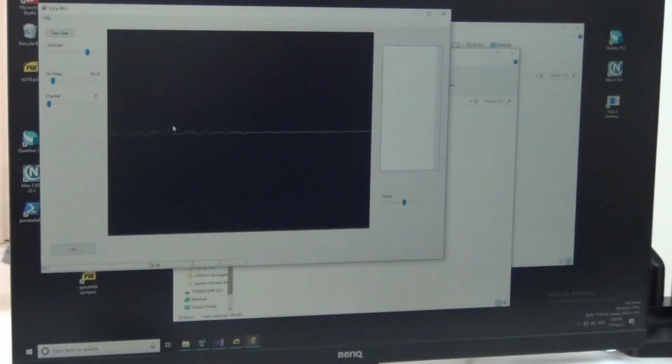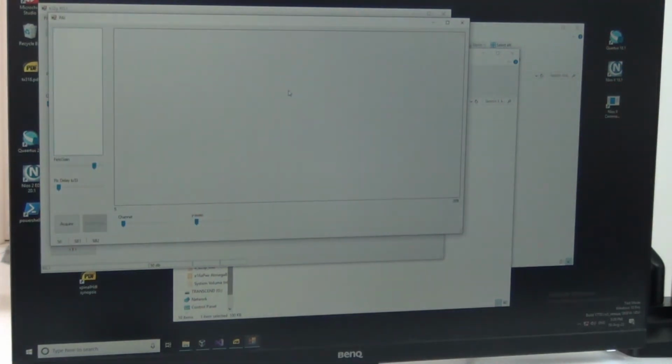Next one will be to acquire the photoacoustic signal. So similarly I switch on. Go through the same raw data acquisition. This is scan. Now I'll freeze it. Once I freeze it, I get this button, photoacoustic imaging button. Click on this, we get this screen. And now I'll say acquire.